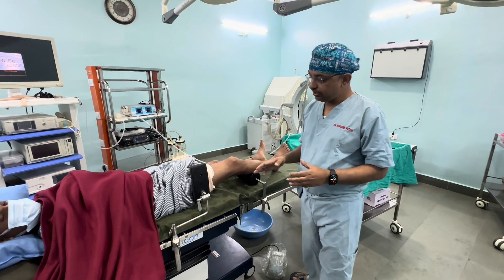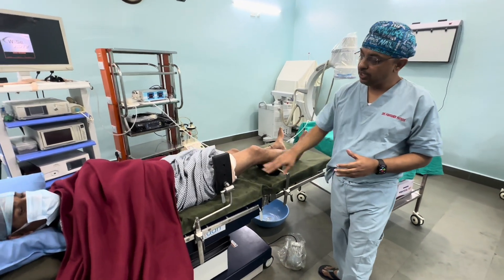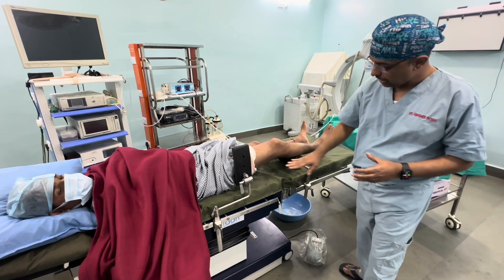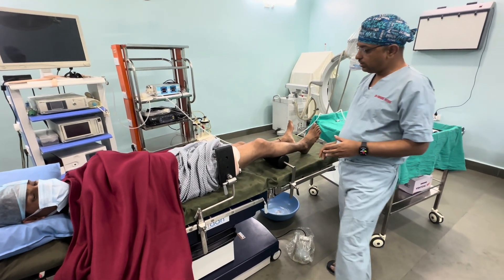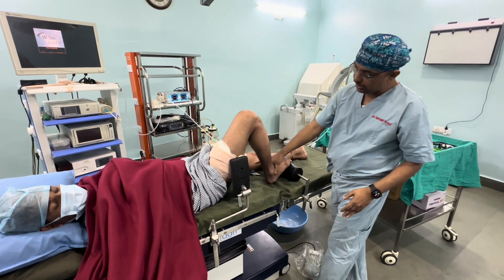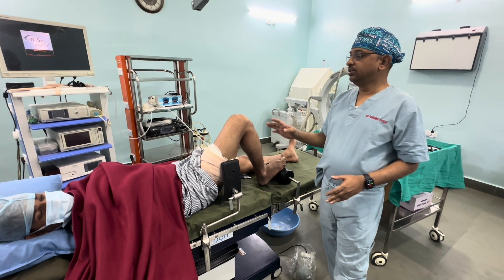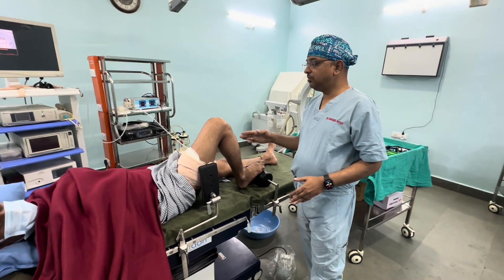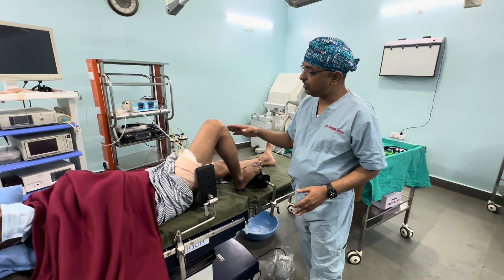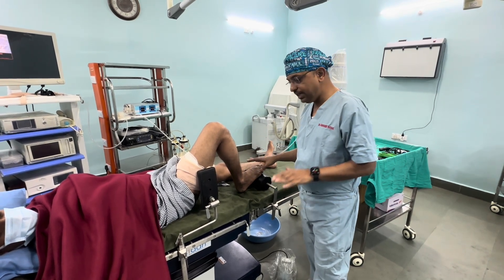When we position the patient supine without breaking the table, we keep a thigh support and a bolster so that when we hold the knee at around 120 degrees we need minimal assistance, and we can achieve hyperflexion so that we can get the right tunnel placement for ACL.